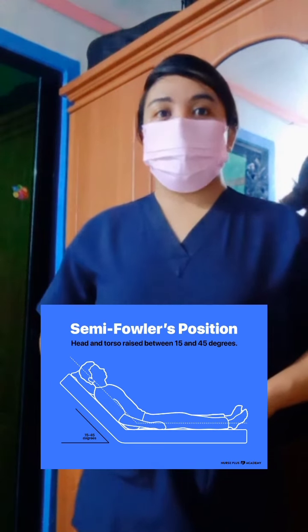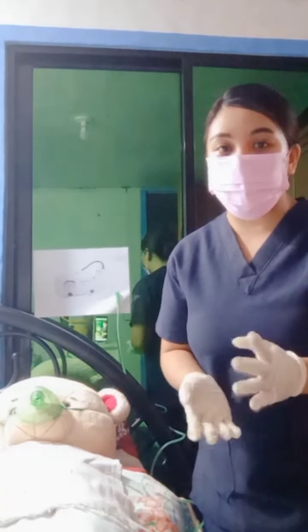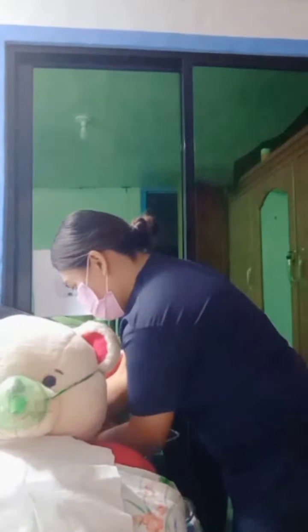After that, you need to set the bed for comfortable height to work, and then lower the side rails where you will work. If the client is conscious, you need to position the client to a semi-Fowler's position, and if the patient is unconscious, you need to place the client in the sideline position, facing the healthcare. So first, I will help the patient into the semi-Fowler's position or help her sit up. After positioning the client, you need to place the drape or the clean towel across the client's chest.